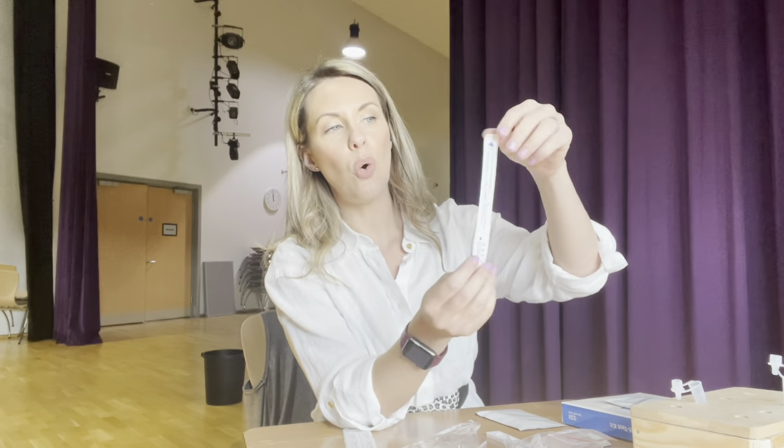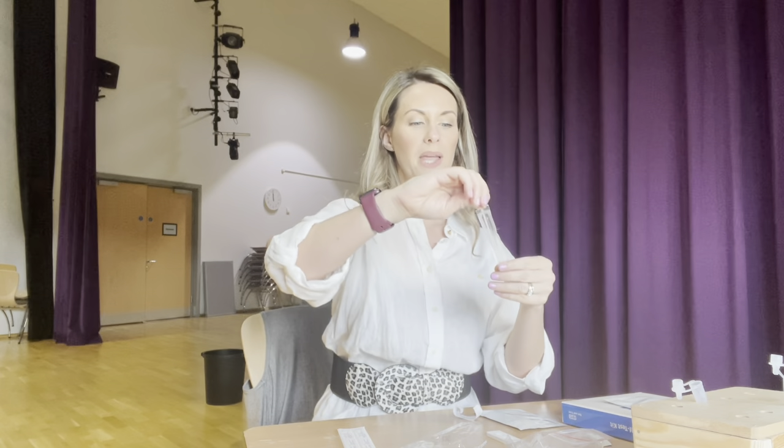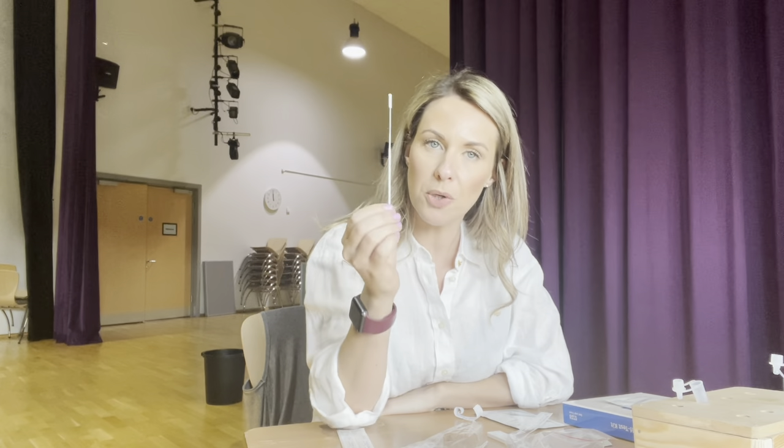You're then going to take your sampling swab and make sure you open it at the end that says 'open'. Take it out making sure that you don't touch the cotton bud end, because that is the end that is going to go at the back of your throat.